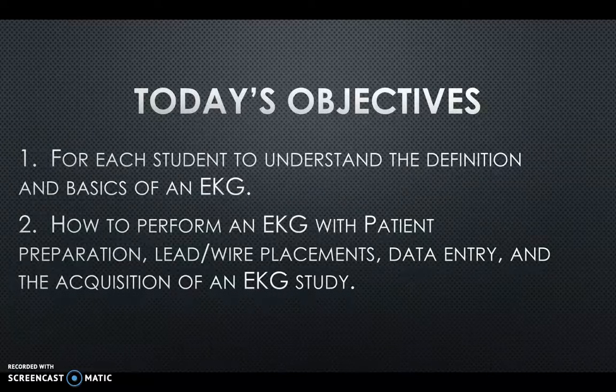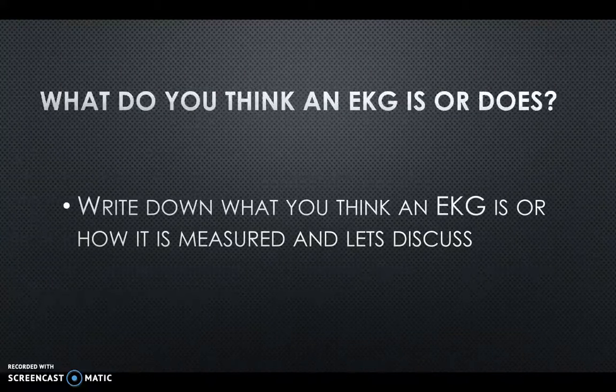Today's objectives are for each student to understand the definition and basics of an EKG, and then how to perform an EKG with the patient preparation, correct lead wire placements, data entry, and of course the acquisition of an EKG study. Now, before we go any further, we'd like to know what you think an EKG is or does. Write down what you think an EKG is or how it's measured, and let's discuss.